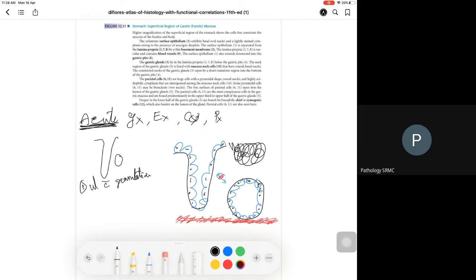Number 2, imagine these are all the neutrophils. The red are the neutrophils. Neutrophils in the epithelium. The neutrophils normally should be in the lamina propria. And as you all know, lamina propria is full of minute capillaries. That's why neutrophils are sitting there, and looking at neutrophils or lymphocytes in the lamina propria, you should not call it acute or chronic inflammation. You have to see the neutrophils in the epithelium, and that is known as, for example, in the colon, cryptitis.